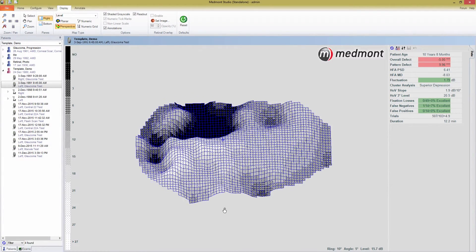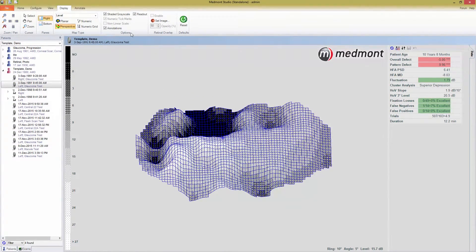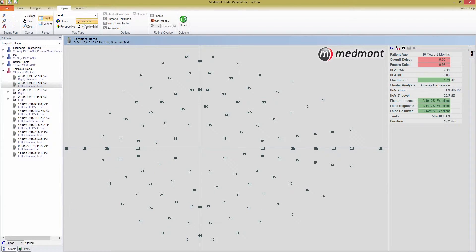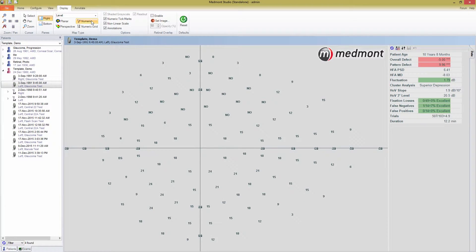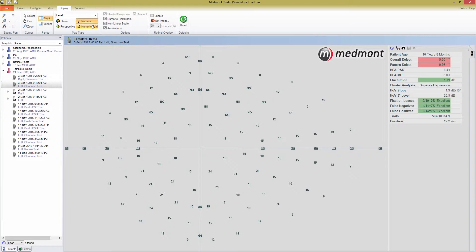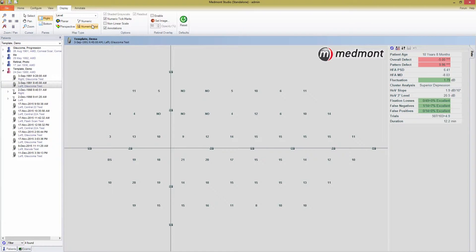For Humphrey users, the numeric grid will be familiar. The M700 perimeter layout is set around a polar coordinate system, and the numeric view is how the data is collected. In the numeric grid layout, we simply convert this to the linear grid system used by Humphrey field analyzers, which maintains the quality of the data, but may make it easier to visualize for those used to the Humphrey layout.